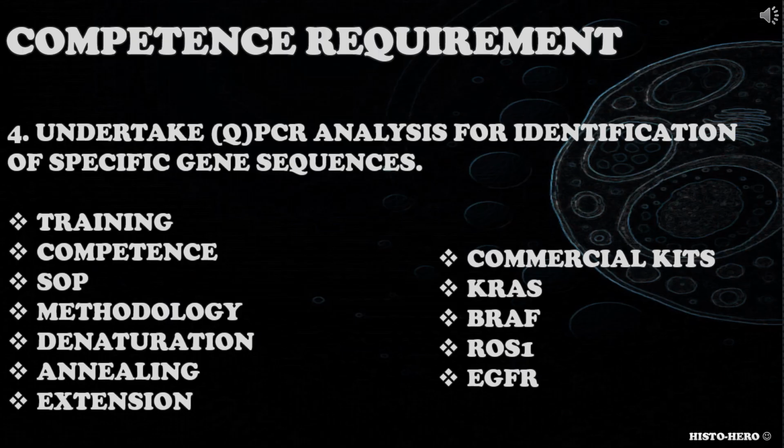When addressing this competence requirement, candidate could consider their training and competence, SOPs, methodology used, sample preparation, denaturation, annealing, extension, specific gene sequence, commercial kits available to detect KRAS, BRAF, ROS1 and others.